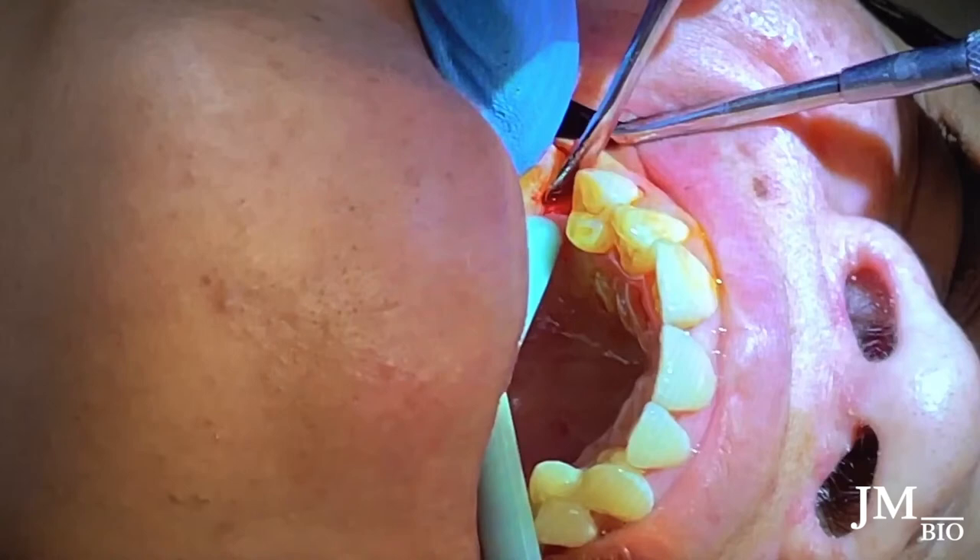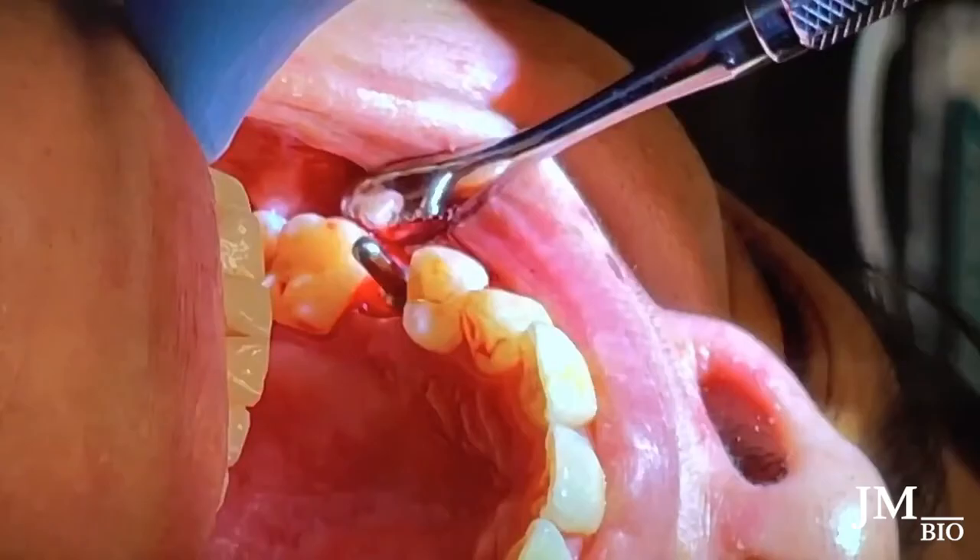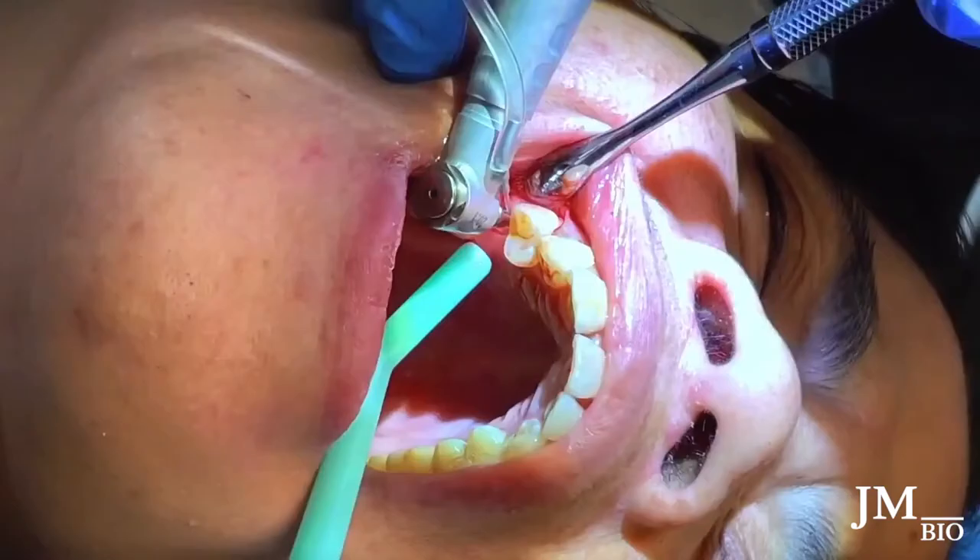Then I do my osteotomies. I already did the first initial pilot drill, so this is the next drill — the 2.2 twist drill — going down to the depth I want. I'll put the parallel pin in, check the bite, and check the mesial-distal angulation, buccal-lingual angulation, and whether it's pointing toward the functional cusp. If I don't like it, I'll correct with the next drill.